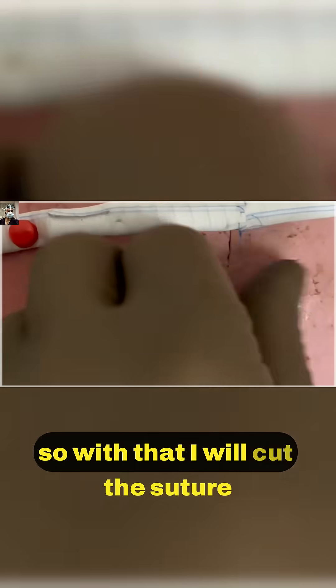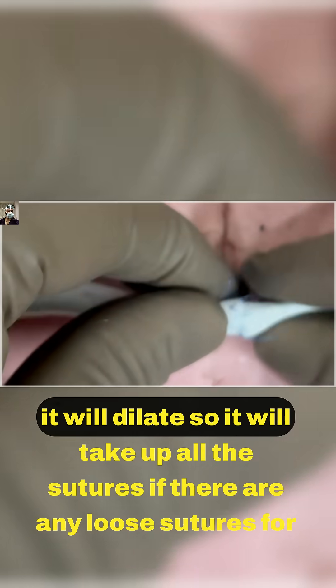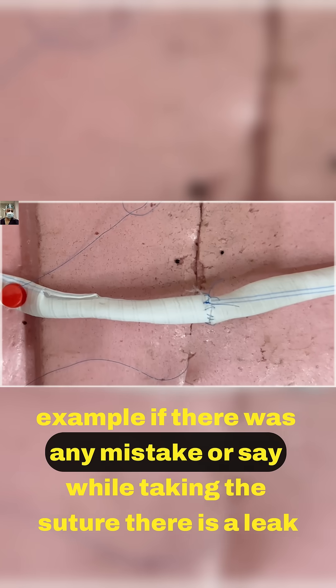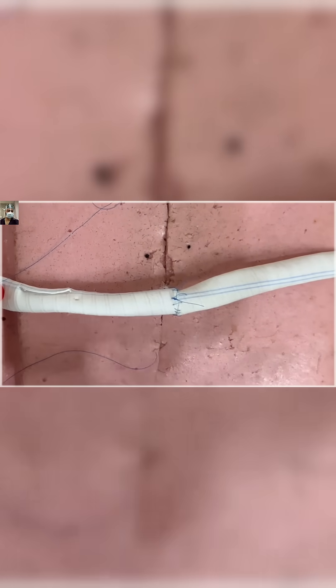With that I will cut the suture, and as it dilates it will take up all the sutures. If there are any loose sutures — for example, if there was any mistake or there is a leak while taking the suture — no need to panic.